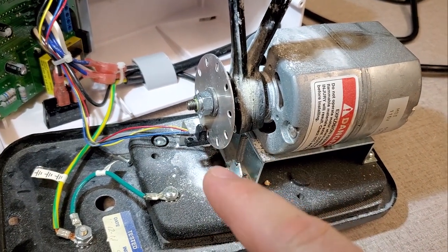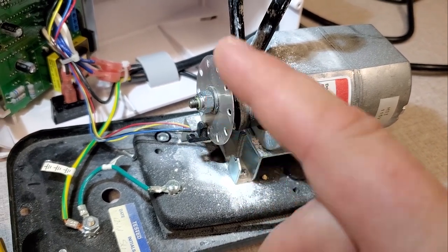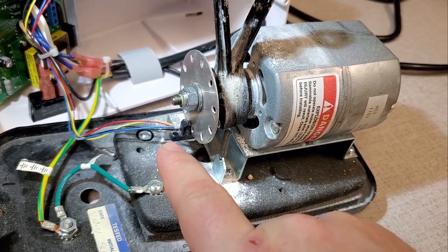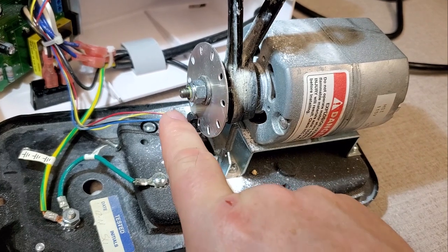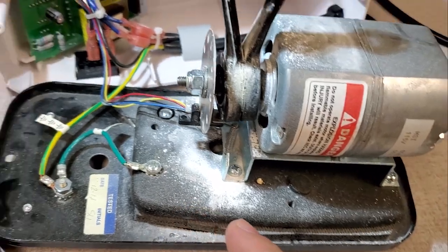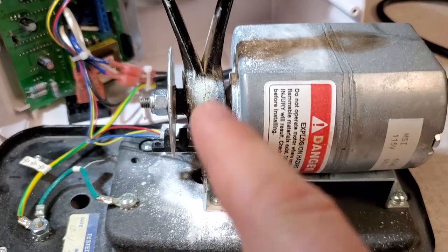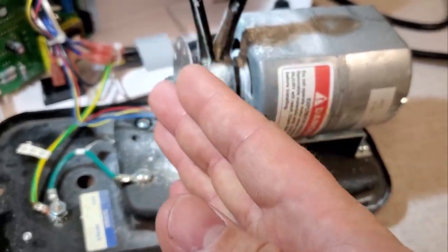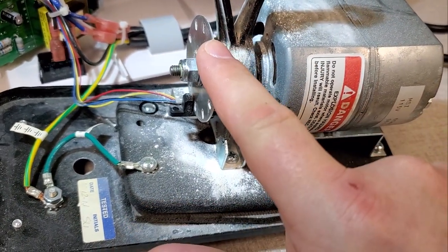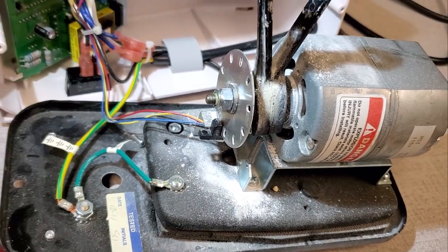So if this unit has a problem, let's say it throws an error code instantly, or it doesn't keep a routine schedule when you tell it to go for 15 seconds, it shuts off prematurely or whatever. This little opto interrupter right down here relies on light, and it shoots a light from one side of this disc, and it's detected on the other side over here. And all this powder gets down there and it blocks those diodes from being able to transmit the light. So it thinks that your motor is stuck and it's never spinning, even though it could probably be spinning.